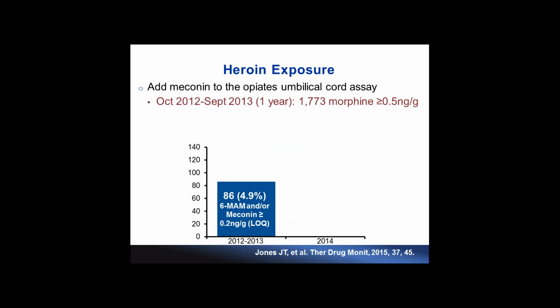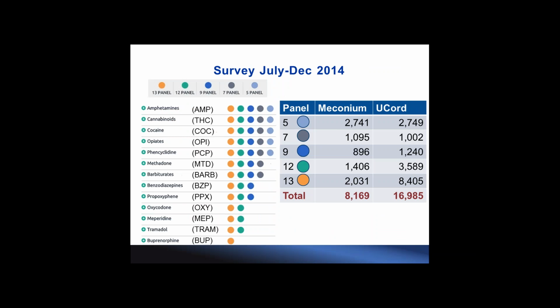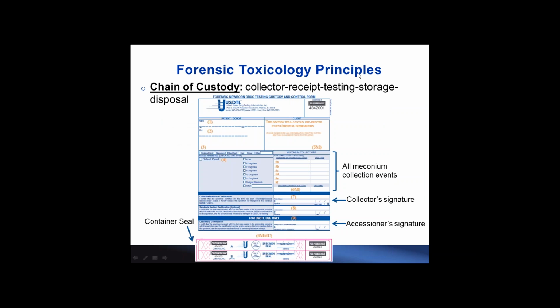Okay. For those who cannot hear what Michelle just said, she mentioned that we do have specific collections for any type of newborn specimens. And I'm going back to the slides where the chain of custody form looks like. Here it is. If you can see it well enough, there is a checkbox for umbilical cord, meconium, blood spot, hair, and urine. So at least for the form, there is some specimen type available if you choose to send the specimens for us to test.